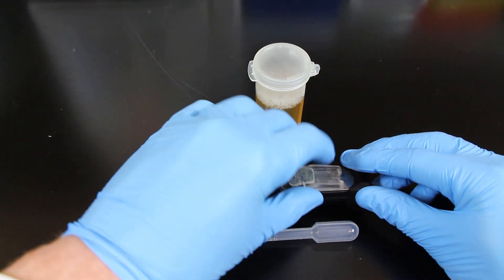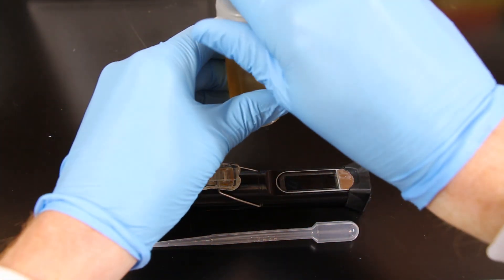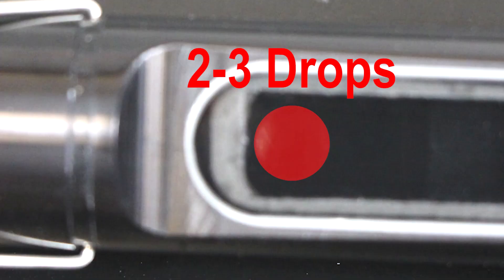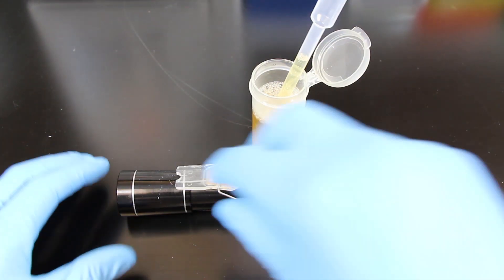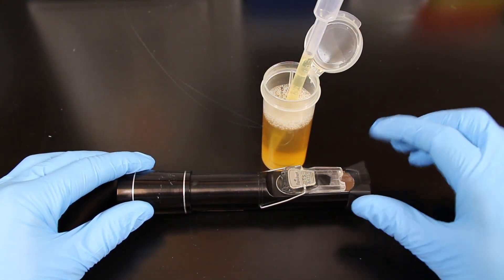All you have to do is take the refractometer, open up the top, and put two to three drops of urine using a transfer pipette right into the little circle hole underneath the glass of the refractometer. Make sure you get it onto that hole, and then close the lid back over, and you'll see that the urine gets spread out across that piece of glass on the top of the refractometer.